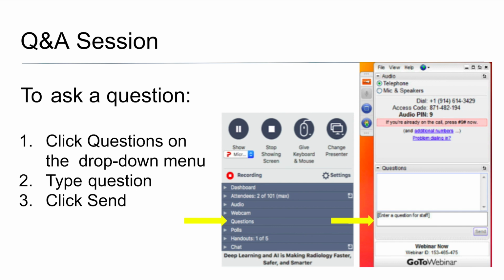And so for the more realistic simulation for the low dose, what people usually do is randomly or uniformly undersample it and try to act as if only a certain percent of the events were collected, which means as if there's a certain amount of activations going on.